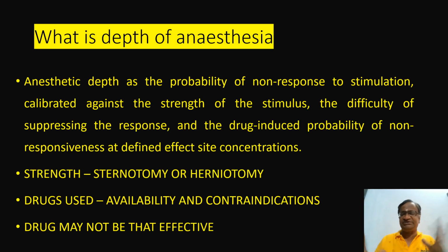So, what is depth of anesthesia? It is a probability of non-response to stimulation. If you stimulate, what is the probability that the patient will not respond? What is it calibrated against? Strength of the stimulus, the difficulty of suppressing the response, and the drug-induced probability of non-responsiveness.